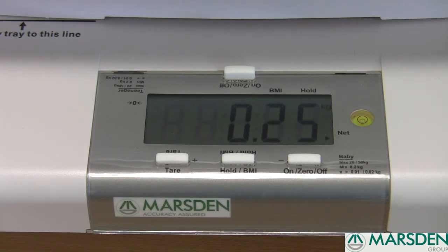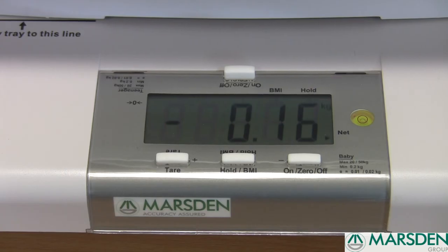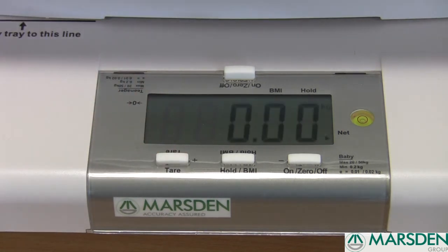Once you've taken your baby's weight, you can remove the matting and press the tear function once again, which will take the scale back down to zero, enabling you to weigh your next patient.